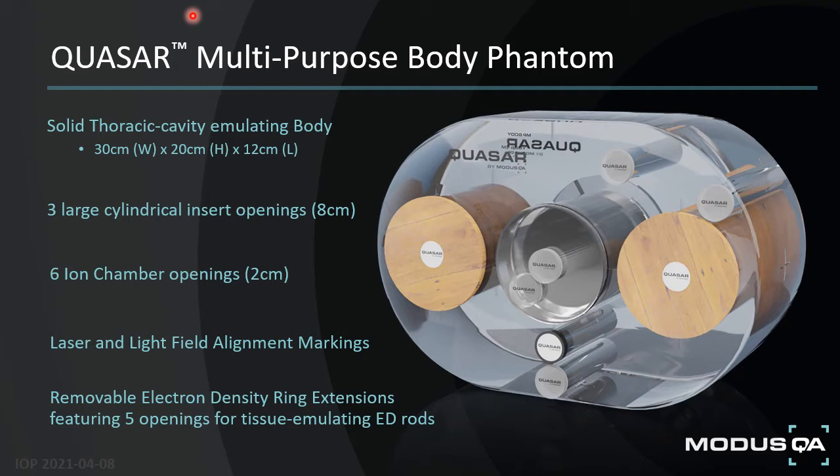It should be noted that with the exception of these 4 smaller diameter holes, the phantom body is perfectly symmetrical in the X, Y, and Z directions, meaning that if you were to turn the phantom 180 degrees, one will have access to a total of 12 possible ion chamber locations, all available for your liking.